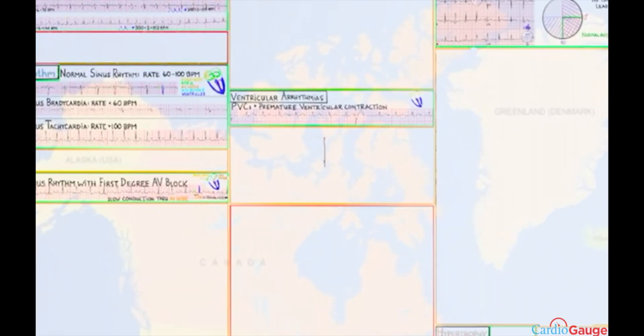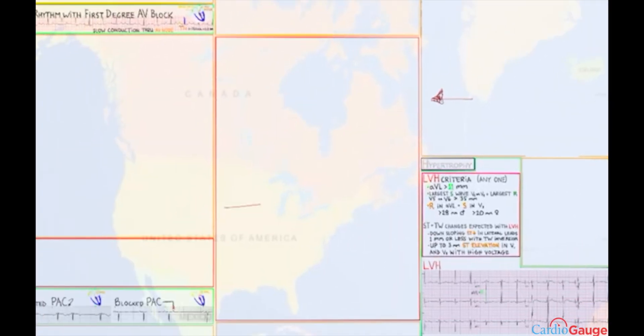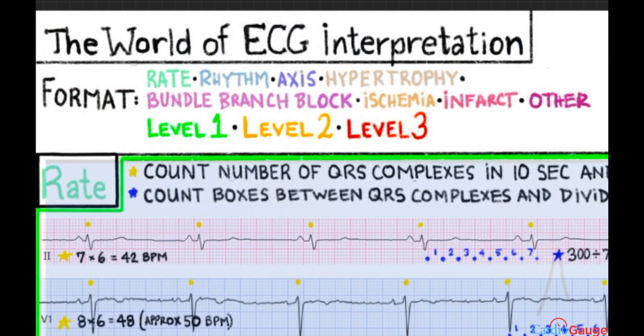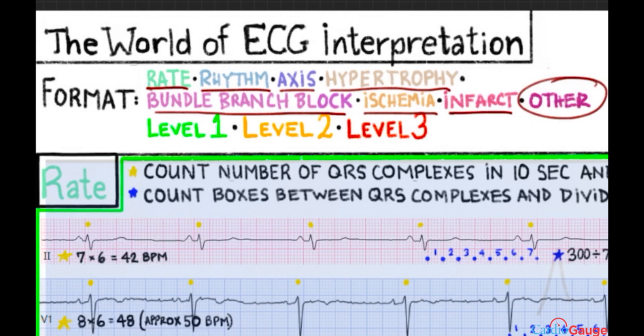This is the world of ECGs. First, a couple of notes about the format. You're going to see green boxes with level one information, orange boxes with level two information, and red boxes with level three information. When you're on level one, you can't see what's in orange or red boxes to keep the information more manageable. The format I go through ECG information is: rate, rhythm, axis, hypertrophy, bundle branch block, signs of ischemia and infarct, and then everything else. That's how I read ECGs myself and how I teach people to read ECGs in that order.